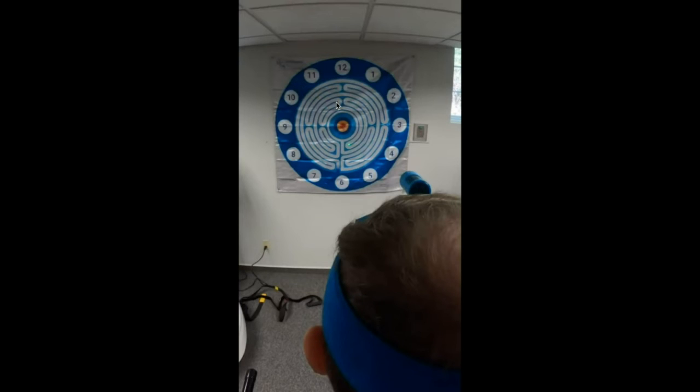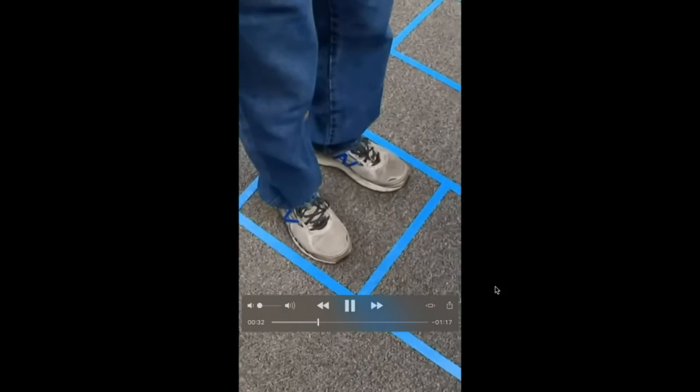So we'll time her start down here to finish, or she'll go in reverse and go from the finish back down to the start. And she's noticing improvements that carry over into real time. She's starting to change her thought process when she gets the tremor, to stop focusing on the tremor, but focusing on the breakthroughs. So this will hopefully be encouraging in this population, maybe with some research in the future for anybody who's interested in this population. Maybe look for that coming up.